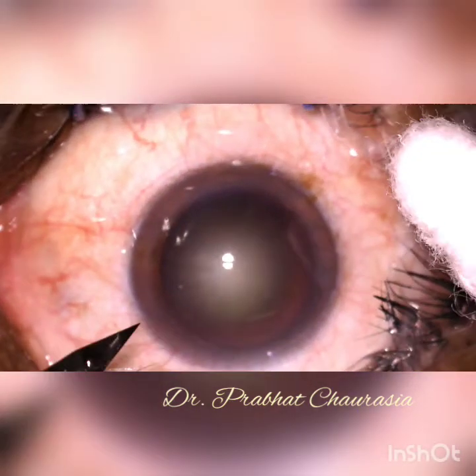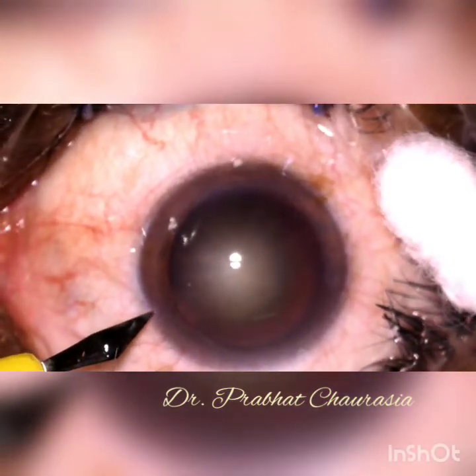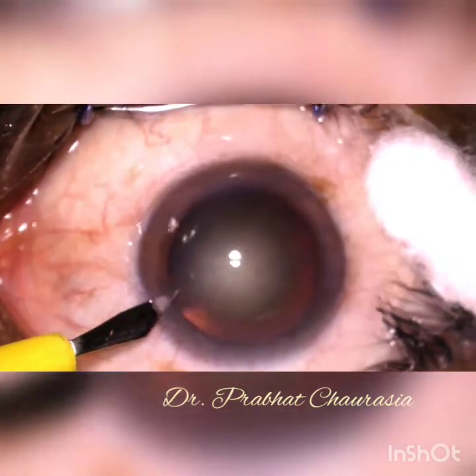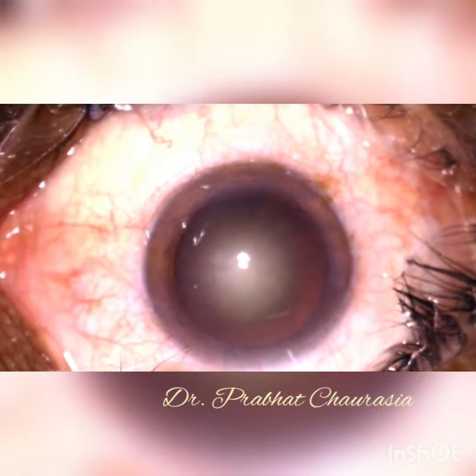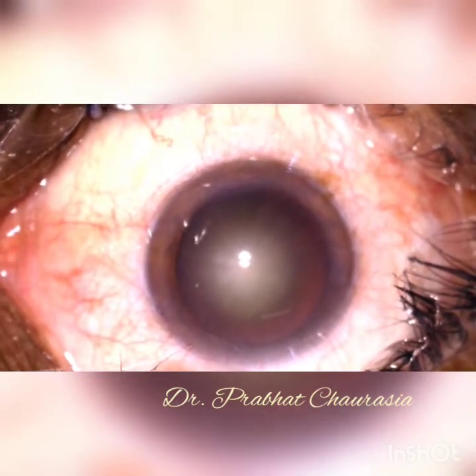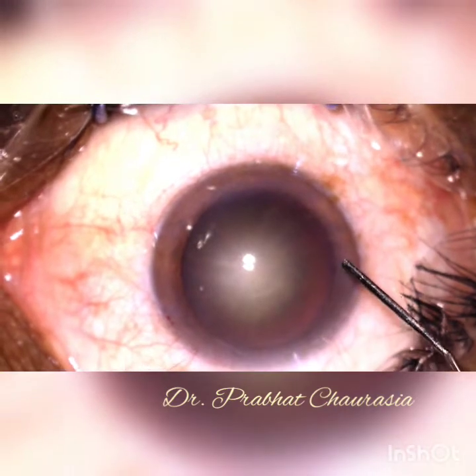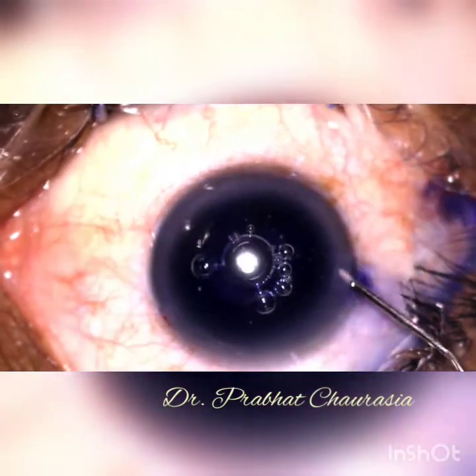My dear friends, today after a long time, I am uploading this video on YouTube for the beginners. I am trying to show the phacoemulsification surgery of a grade 4 nuclear sclerosis patient.